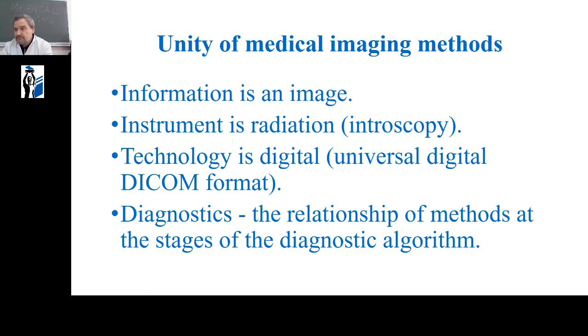It differs in its properties from those image formats that we use in everyday life, photographing our loved ones, animals, nature, etc. DICOM format has greater depth and power than household formats.